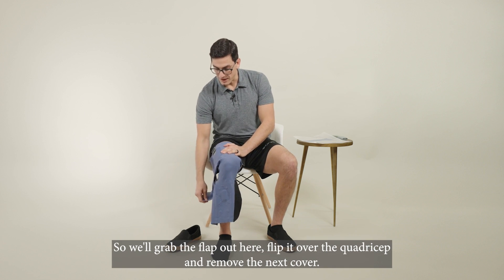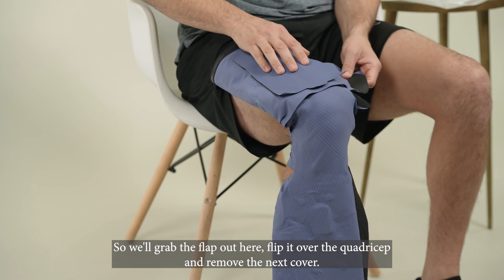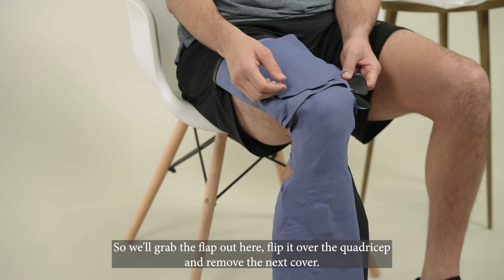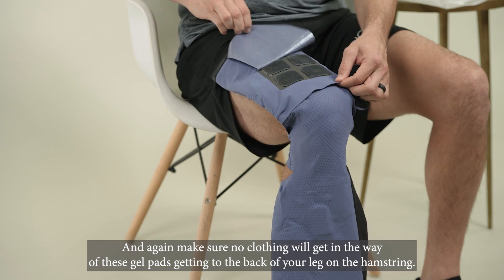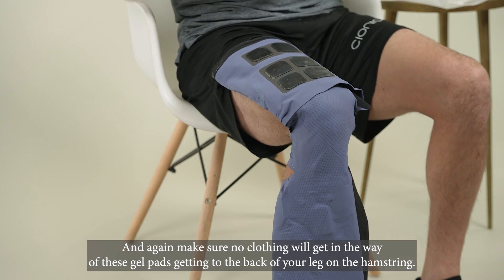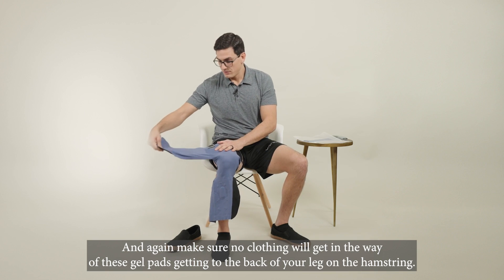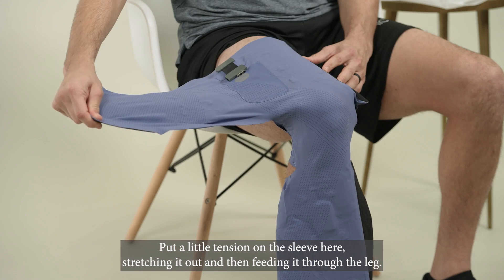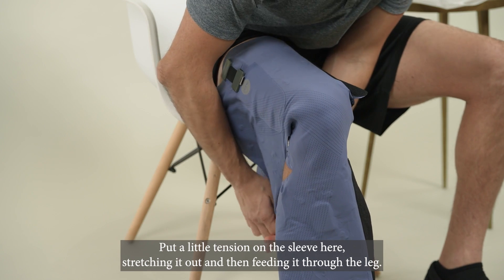We'll grab the flap out here, flip it over the quadricep, and remove the next cover. Make sure no clothing will get in the way of these gel pads getting to the back of your leg on the hamstring. Put a little tension on the sleeve here, stretching it out, and then feeding it through the leg.